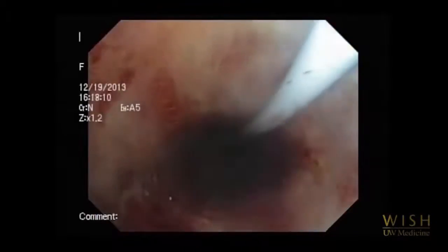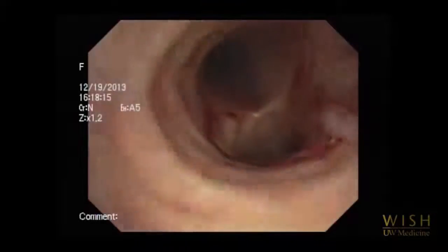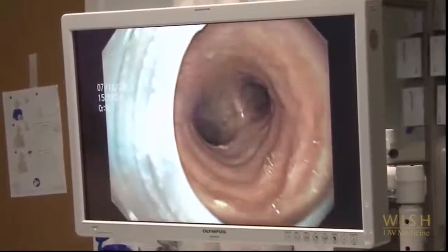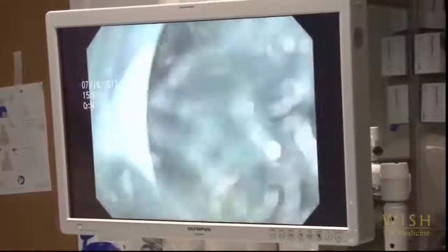Once inserted, the bronchoscope is guided as far as possible into the peripheral airway of the target location, avoiding use of suction if possible. Additional 1 to 2 milliliters of 2% lidocaine can be administered and directed at the carina and other bronchial bifurcations to decrease the airway irritation associated with bronchoscopy.